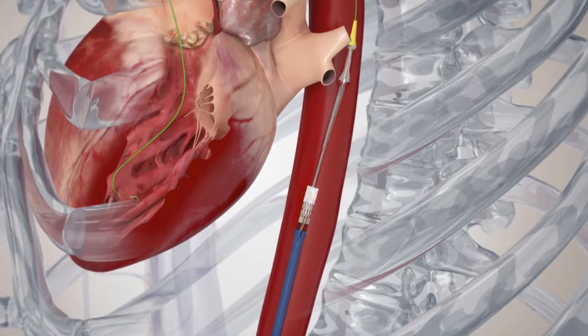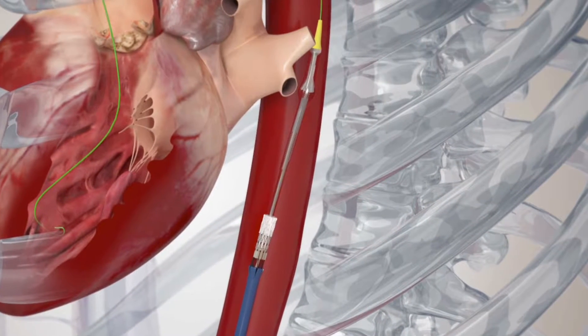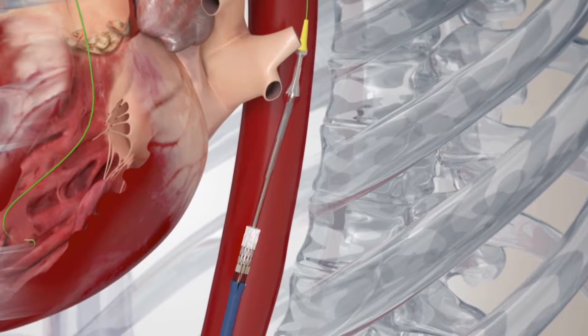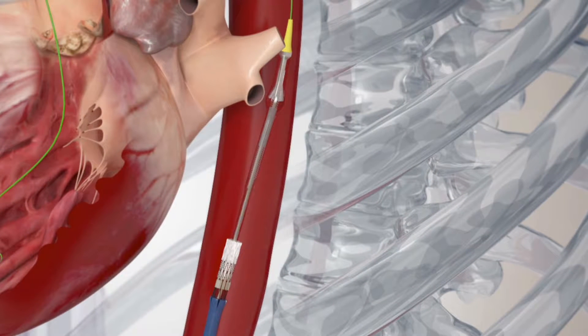In order to keep the crimped valve as thin as possible, which in turn keeps the puncture in the femoral artery as small as possible, the valve and deployment balloon are kept separated until after both are in the descending aorta.